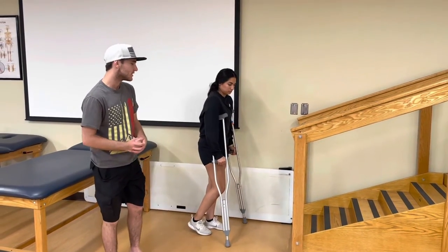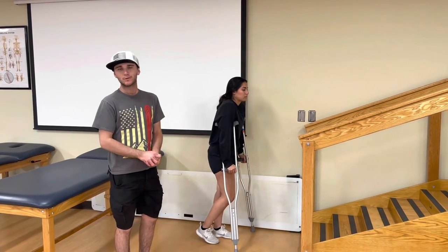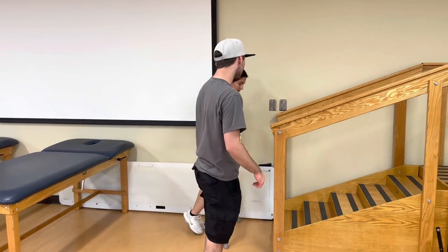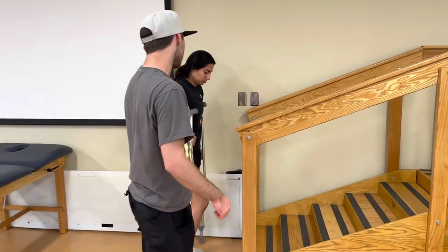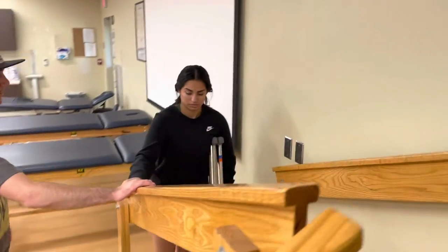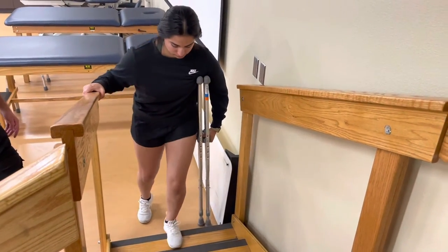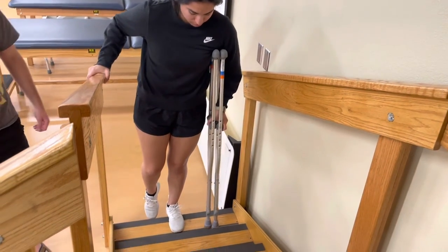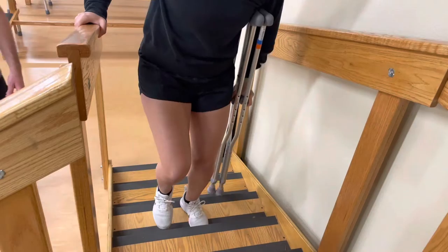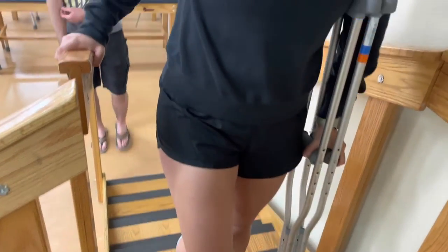Now we're going to work on going up and down stairs. A good rule of thumb is: up with the good, down with the bad. To go up, come to the first step, move your crutch over to your other arm so you're holding both, then grab onto the railing with your free arm. Step up with your good leg, bring the other up, step up again with your good leg, bring the crutch up, and so on until you reach the top. Make sure you're leaning forward so you don't fall backwards.